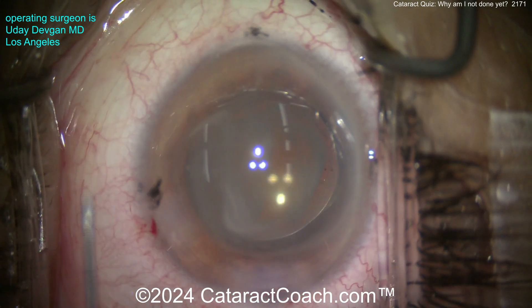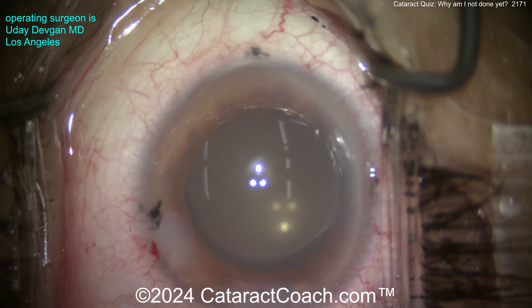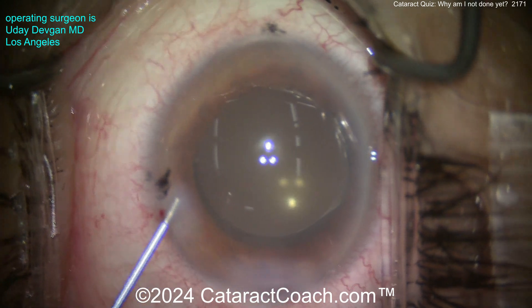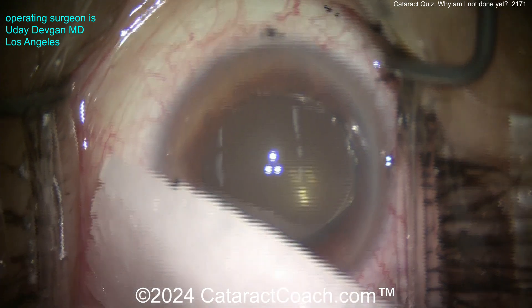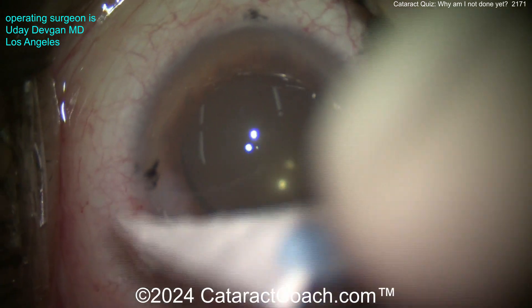At the end of the case, viscoelastic is not present in the eye — we can tell because we put in triamcinolone and swirl that around the whole eye. You can put in your Miochol or Miostat if you'd like, and your antibiotic, and call it a day. End of the case looks just fine — the patient did beautifully and there were no more retained pieces.